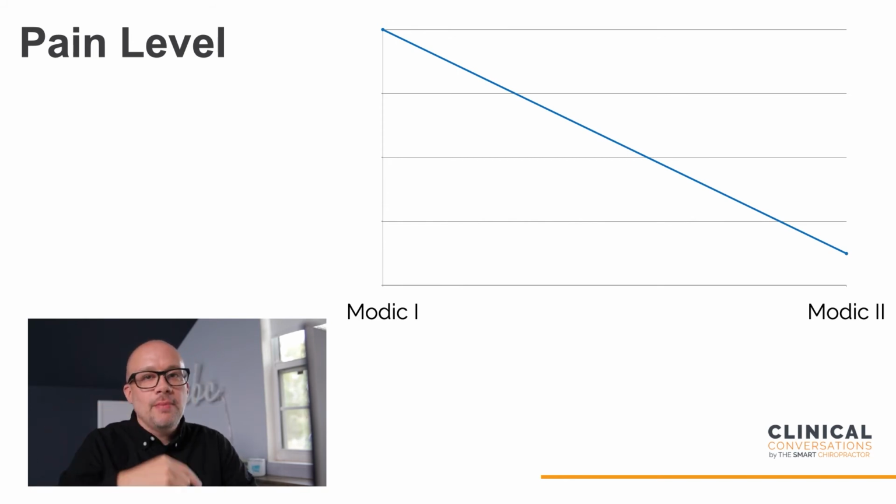However, by the time you get to Modic 2 changes, and definitely by the time you get to Modic 3 changes, the good news is a lot of that pain has rescinded and gone away at that point. So let's take a look at our next slide here.